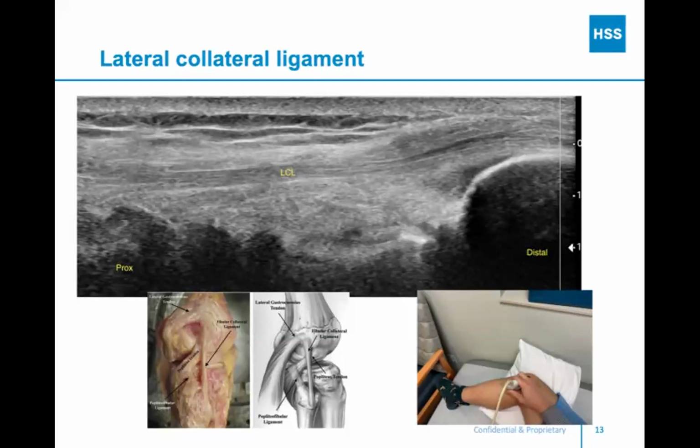And so just scanning a little bit medial on that image that you have right there, just scan a little bit posterior medial, which sounds like an odd direction to say when we're looking at the lateral knee, pulls up that lateral gastroc tendon. And certainly you can have symptoms related to lateral gastroc tendon and ganglion cysts associated with that, fabella, etc. And so I think those are kind of the major structures on the outside of the knee.